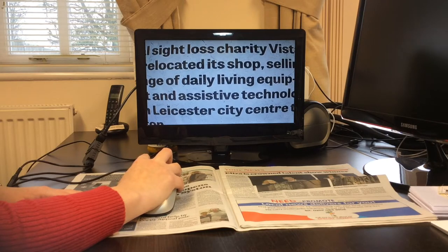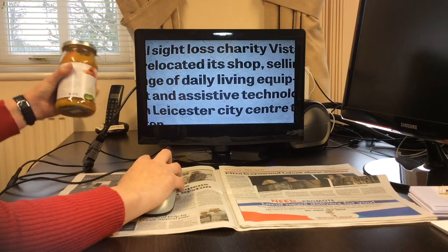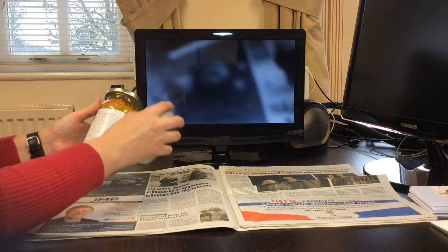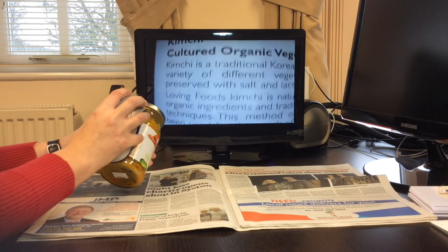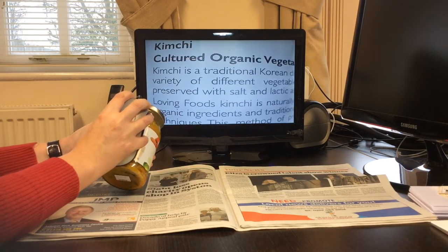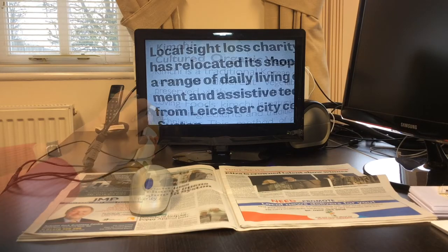The Monomouse is designed to be extremely easy and simple to use, yet still providing the magnification someone with a visual impairment requires. The Monomouse is so versatile you can go from reading a newspaper or book to reading instructions on a can or jar with the text still being in perfect focus.